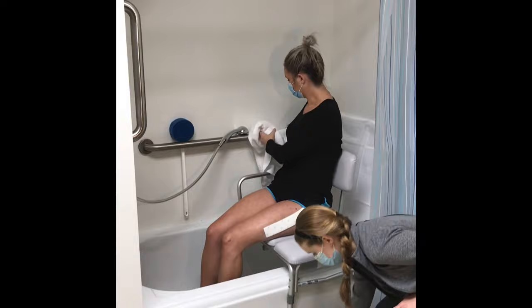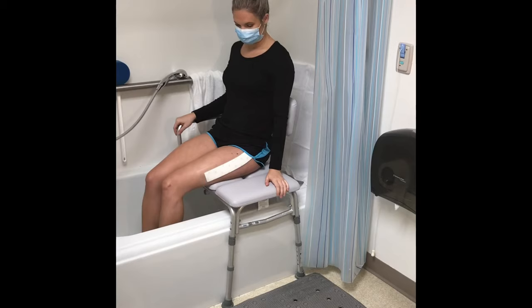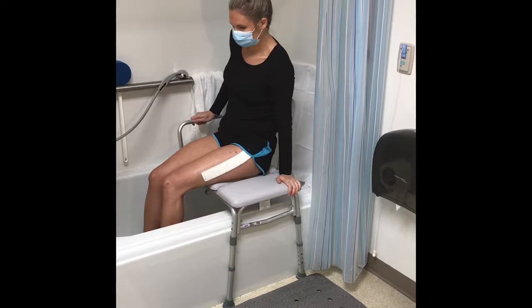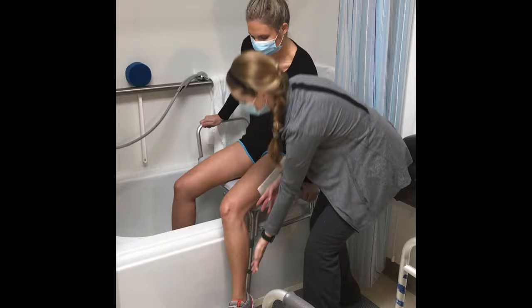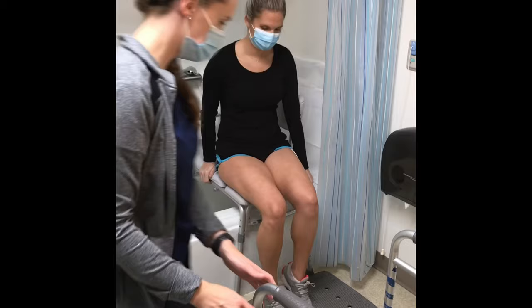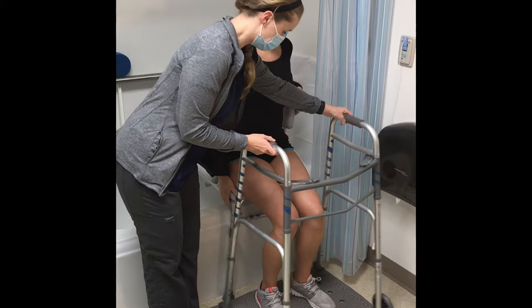Ensure the ground outside of the tub is dry to avoid slipping. Stepping on a non-skid mat is helpful for your safety. When getting out of the tub, scoot toward the end of the bench, then bring your legs over the side of the tub, being careful to avoid bending or twisting your surgical hip. Have a caregiver help you bring your legs out of the tub. Scoot toward the edge of the bench, have your caregiver position the walker in front of you, then push off the seat to stand.